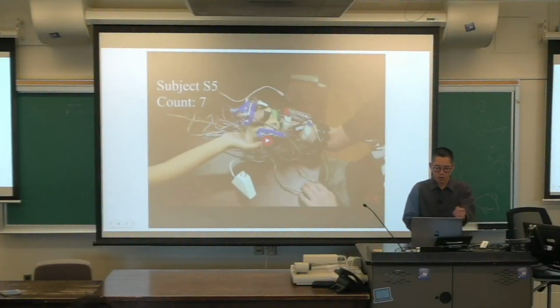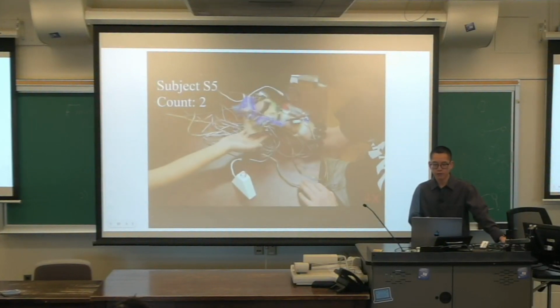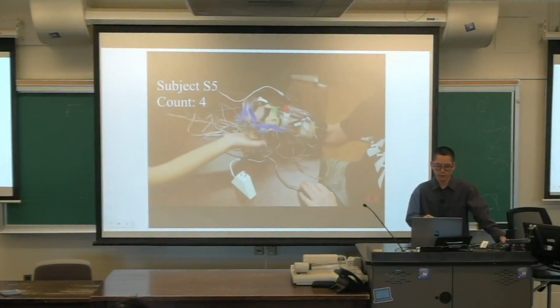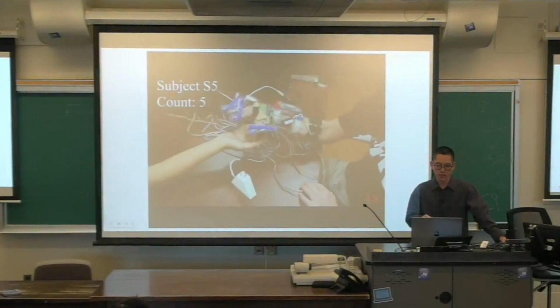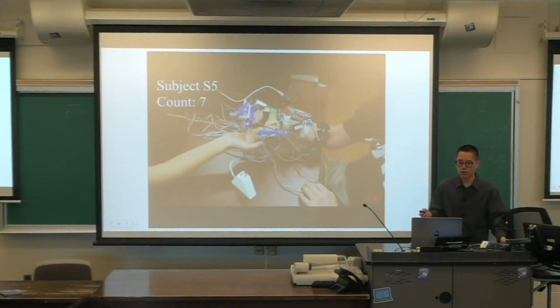And then we evaluate on another subject. Interestingly, for this subject, in the beginning, there are some jerky open and close motions. But in the end, it goes away. We attribute this also to the online updates. He's also able to complete 7 pick and places in 1 minute.